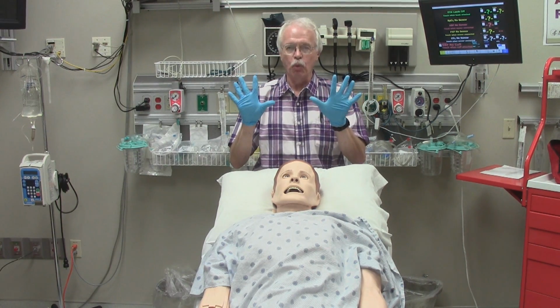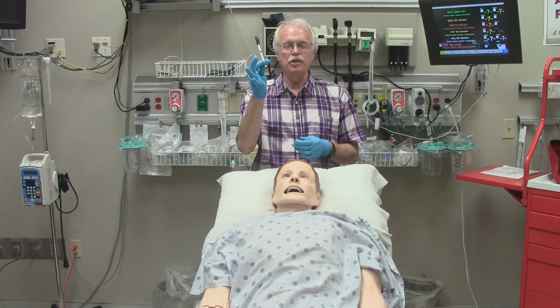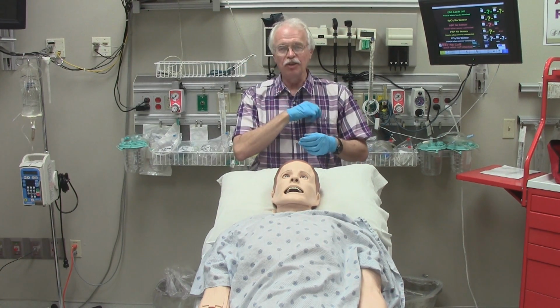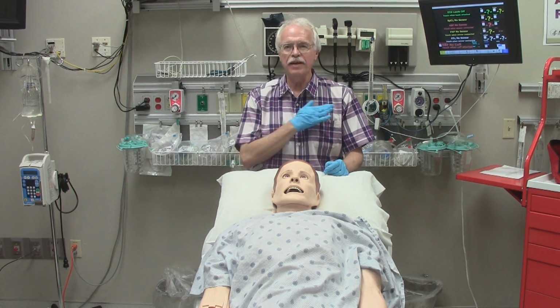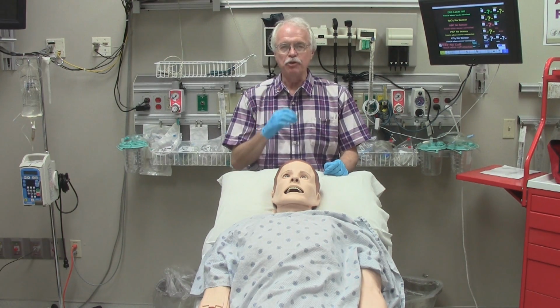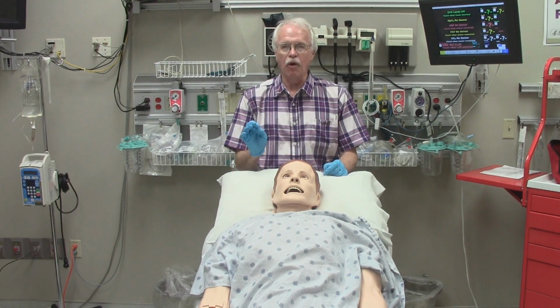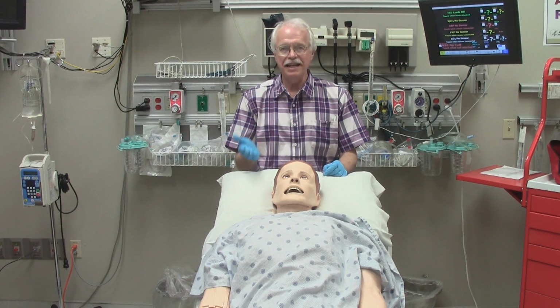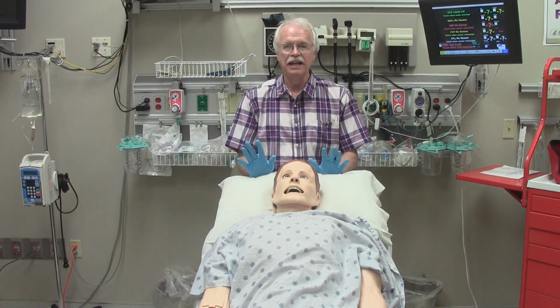So please wear gloves. If you are carrying an ink pen with you, please ideally leave it outside the simulation room. If you feel like you need to carry it, leave it in your pocket at all times. Keep it capped. If you start moving an ink pen around close to the simulator, there's a possibility you may make an ink mark on the plastic. It is almost impossible to get ink from ink pens off of these mannequins, so please no pens anywhere near the mannequin.